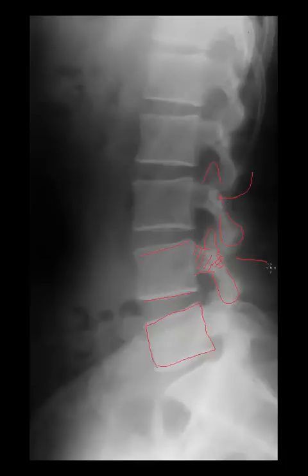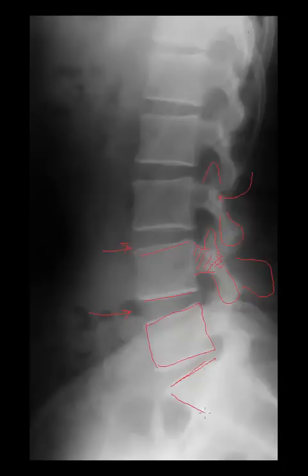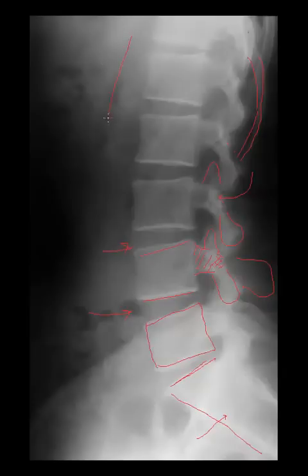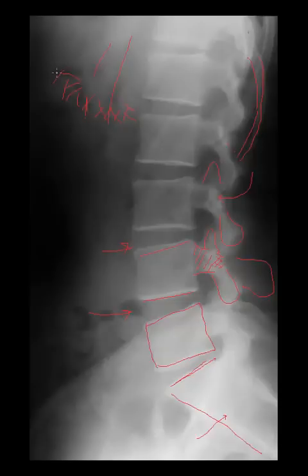To finish our anatomy: here is the spinous process. The lamina in the lumbar spine are very short — visualized well on oblique projections but not well on the lateral. Here are the intervertebral disc spaces, here is the sacral base, here is the anterior margin of the sacrum, and this inconspicuous lucency is the S1-S2 rudimentary disc area. We can also see ribs — here is the posterior aspect of a rib and more anterior aspects of the ribs. You may see calcification within the costal margin at the costochondral junction, which is normal physiological calcification and an incidental finding of no clinical significance.